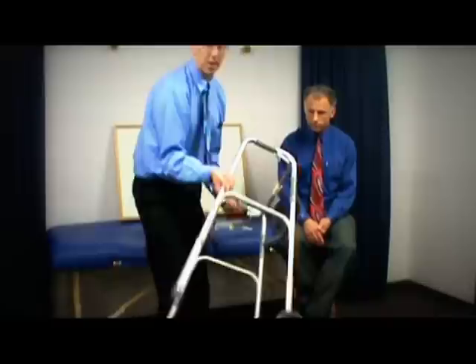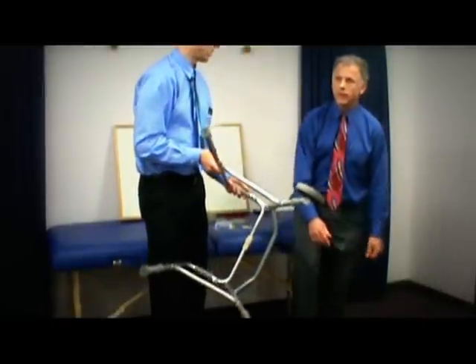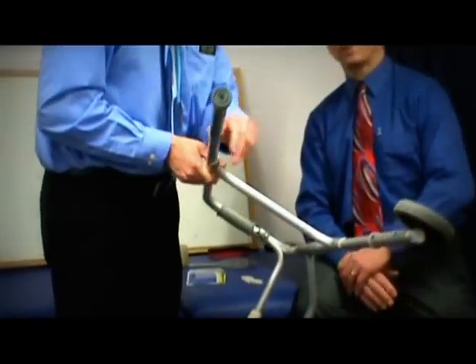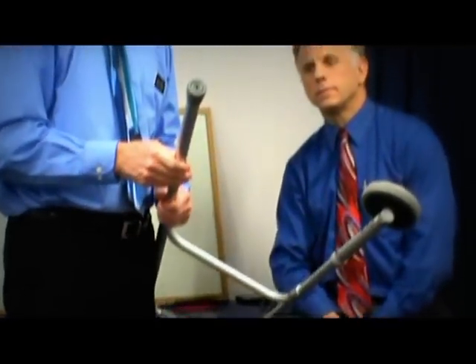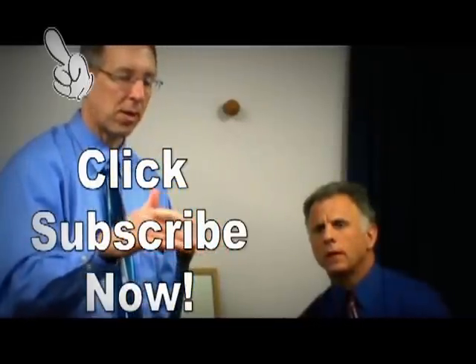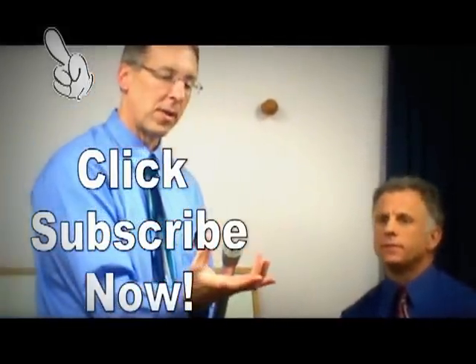A lot of times these walkers come with regular rubber tips on the back. The problem with that is they don't slide very well. So one solution you're going to see is that people buy plastic glides for it. It's a glide that helps the walker glide along. Sometimes they call them skis because of how they look. I'm sorry we don't have one here today.